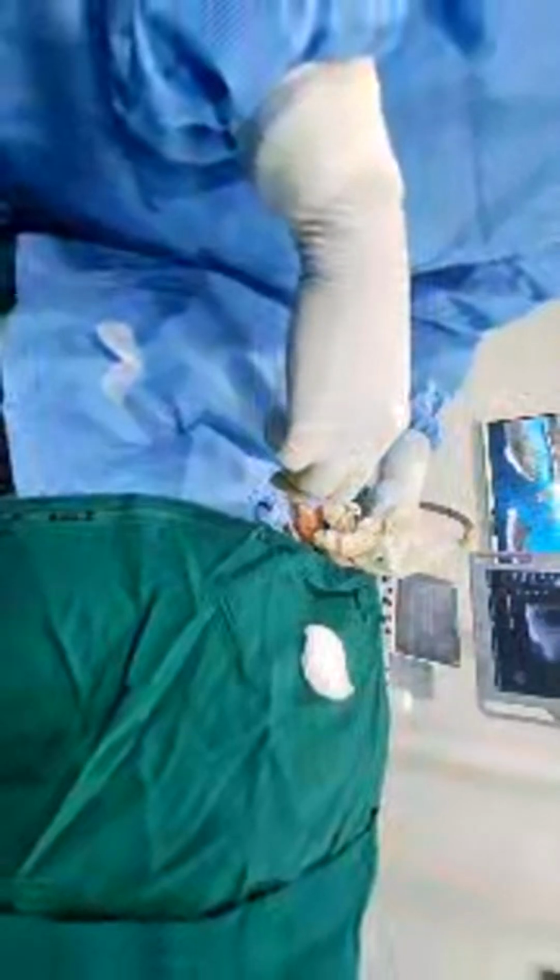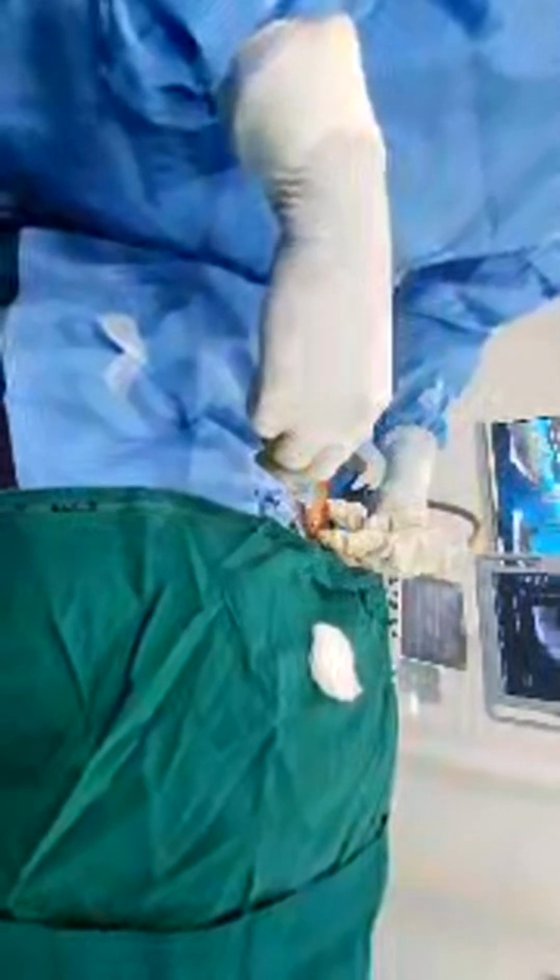By this technique, rather than burning, we do ablation. Using heat treatment, we destroy only the abnormal cells in that nodule, saving the rest of the gland. In this method there is no bleeding, no pain, no cut or scar, and the patient is conscious, as a daycare procedure. That's how we are doing it, completely visible under ultrasound guidance.